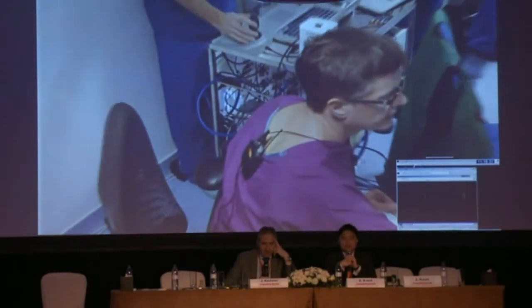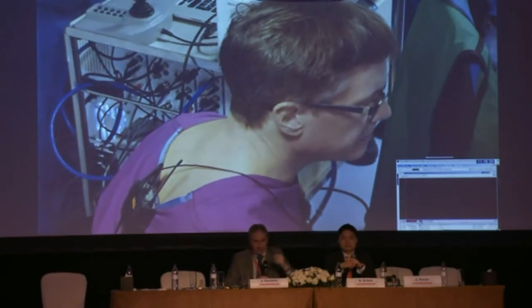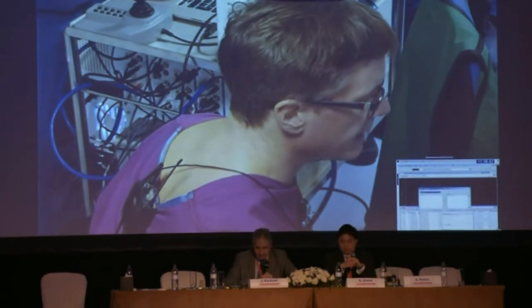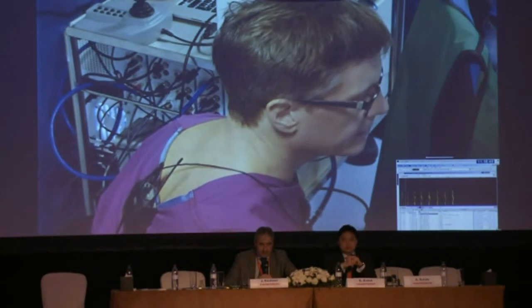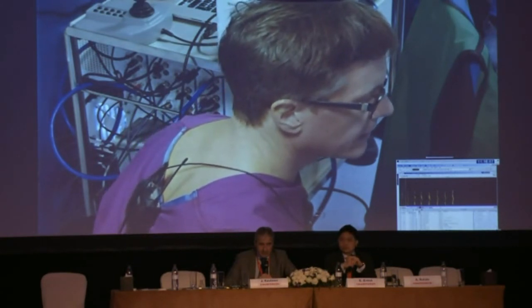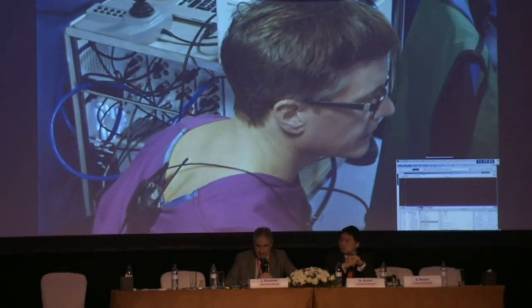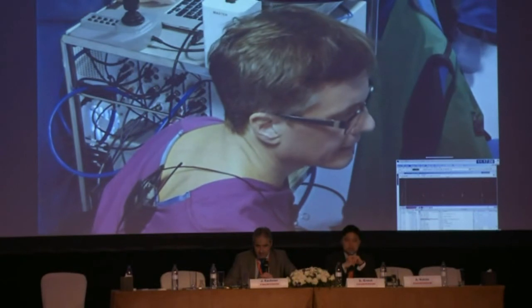So really the key is, it's not the speed of the AF so much as the pattern recognition. So if you can see patterns in it, then you're in business. Let me try and give you an example. I'm just trying to show you the signals here. I don't know whether you can see the signals on the bar, can you? Let me see if I can find a bit where we've got some mapping of the atrium.